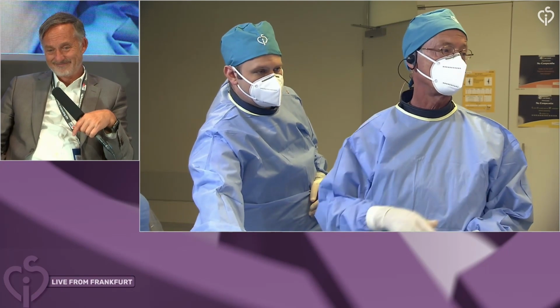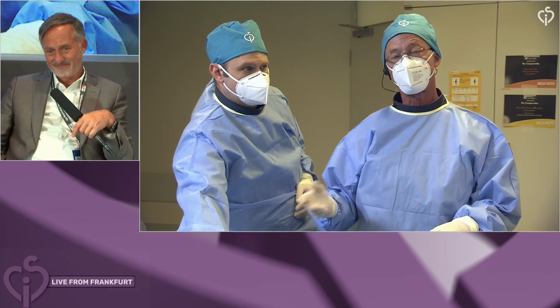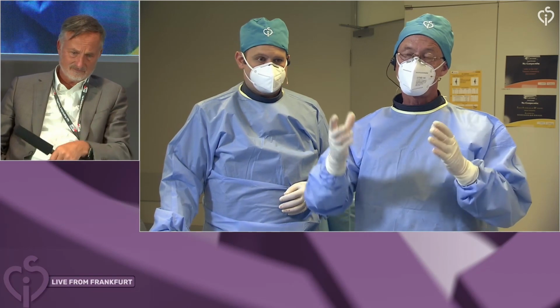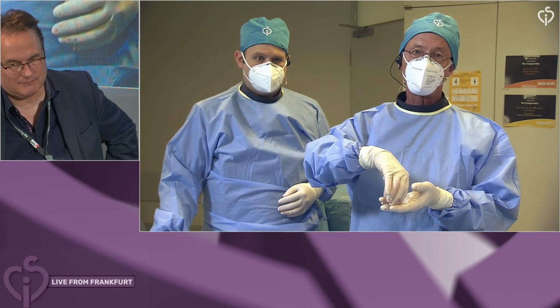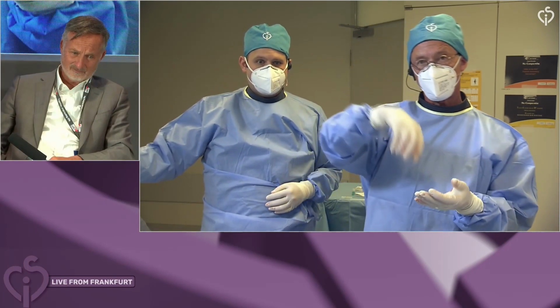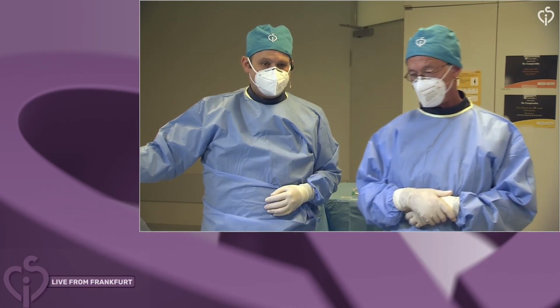I think we can remove the TE probe. I think we don't really know what happens with ASD occluders, which have been implanted in children, 60, 70 years later, because the anatomy of the heart obviously is changing when you get older. And my impression sometimes is that the aortic root, if it is elongated, kind of dives into the heart, and many elderly people have a small interatrial septum. So we don't know whether this has been small from the beginning, or whether it became smaller because the aorta was diving into the heart. That's something I don't know. So I think for that reason, bioresorbable devices will be the future for this kind of procedure.